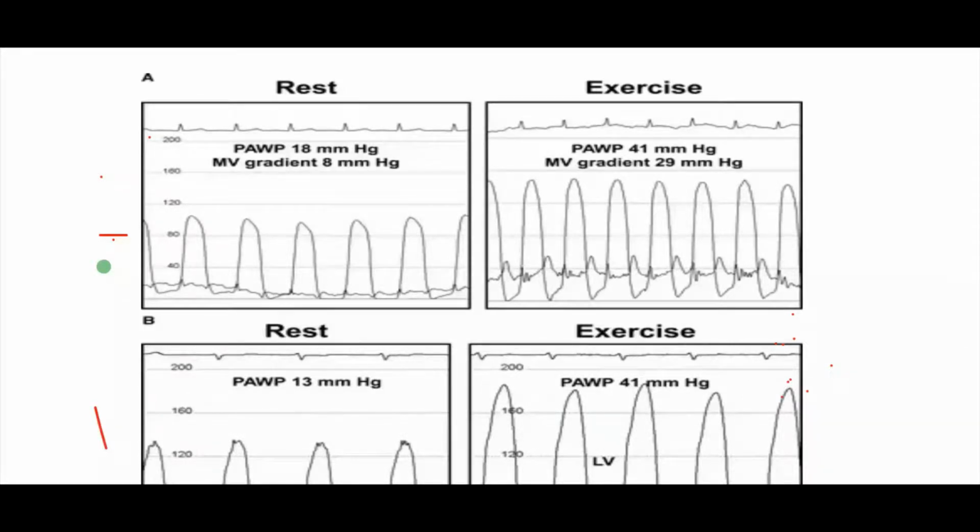Do you wonder how they did exercise in the cath lab? How do they do exercise in the cath lab? Chemical? Not chemical, that was physical exercise. Okay, by hand fisting and upper limb? Hand fisting may be okay, but there is a better way, which is Valsalva maneuver? No. Bicycle ergometer. A bike. Okay, so as if we're inside. Yes, exactly. It's a bicycle.